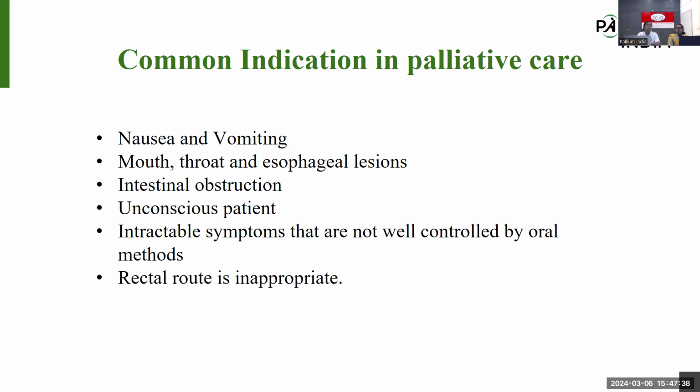The common indication in palliative care, first one is nausea and vomiting. We know most of our palliative patients are receiving chemotherapy and are on narcotics, opioids. So there is a chance of development of nausea and vomiting, and at that time they can't take tablets orally. And due to the long treatment for cancer and chemotherapy, there are no patent IV lines. So at that time we can choose subcutaneous infusion for that patient.